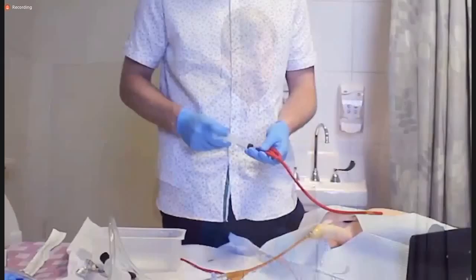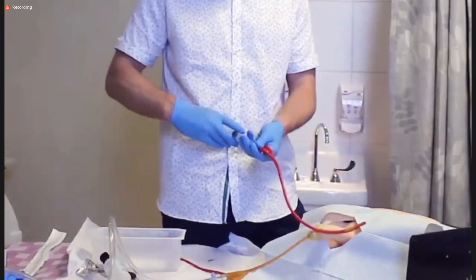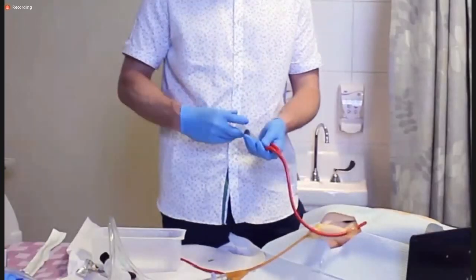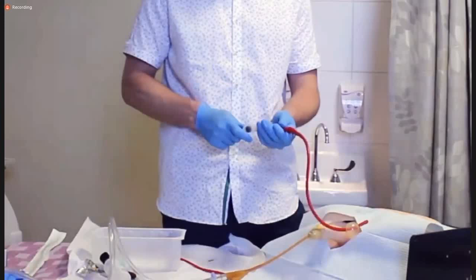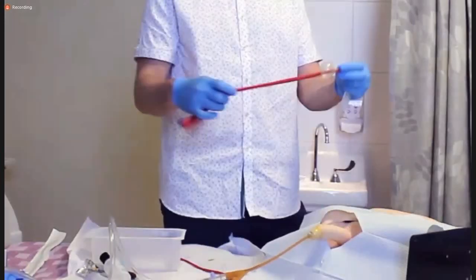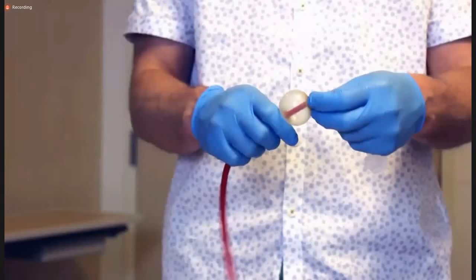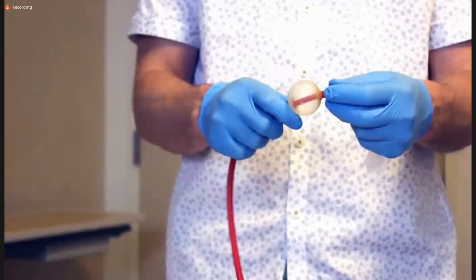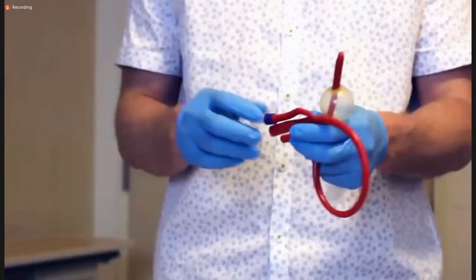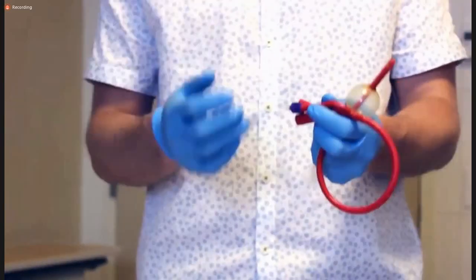So as you can imagine, there is a bit of trauma sustained during that, because if you inflate the catheter balloon to its normal size, and in this case, a 3-way Foley catheter holds about 30 cc's in the balloon, as I'm demonstrating here. So that balloon, when a poor old fella steps on it and pulls it out, it can cause a little bit of urethral trauma. So in these instances, there's a lot of blood through the urethra, but in most cases, you can try to put another catheter in. It'll drain the urine and tamponade any of the bleeding.